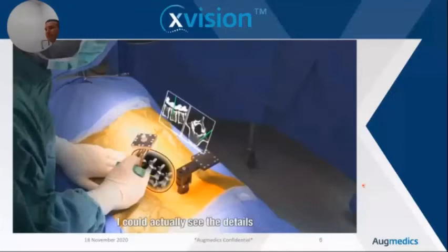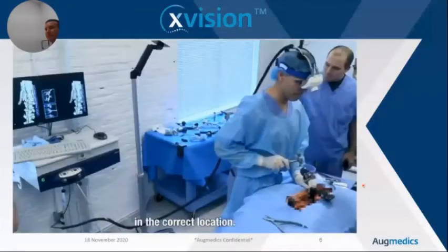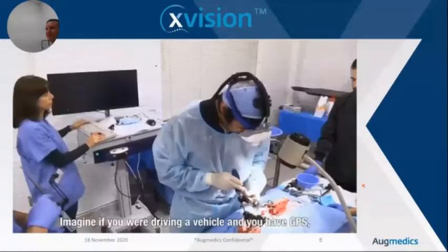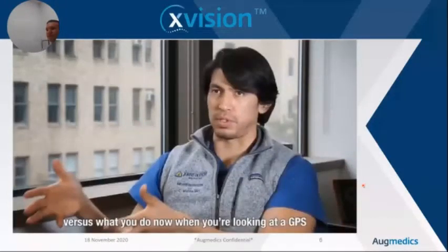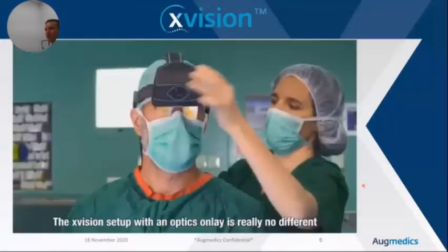Imagine if you were driving a vehicle and you wanted the GPS intuitively displayed translucently onto your windshield so that you're still always looking at the road, versus what you do now, where you're looking at a GPS down on a console or on your phone. So the Xvision setup with the optics onlay is really no different than wearing some type of shield, which is often what surgeons do. This was actually made easy to use and it was translucent. You can see through the actual image.